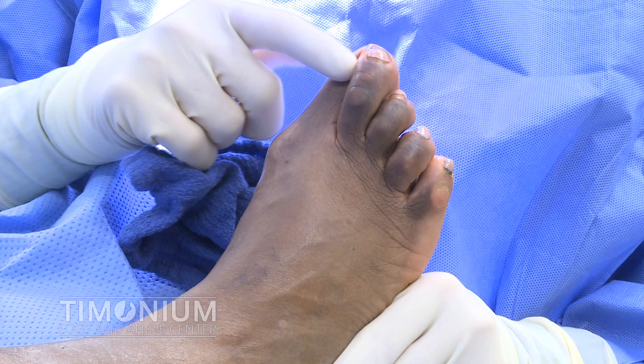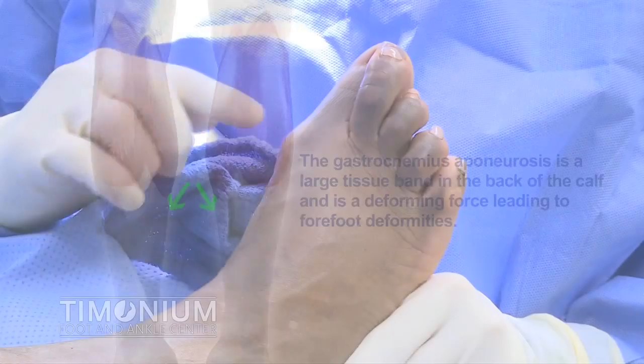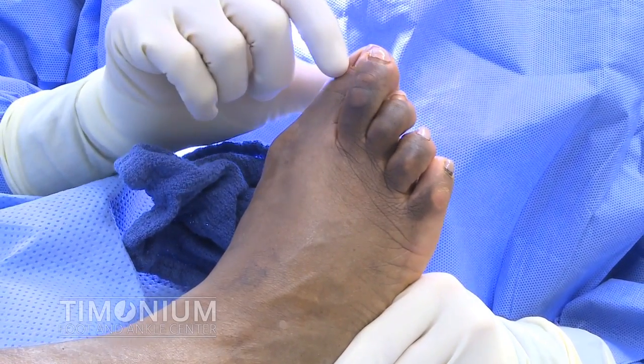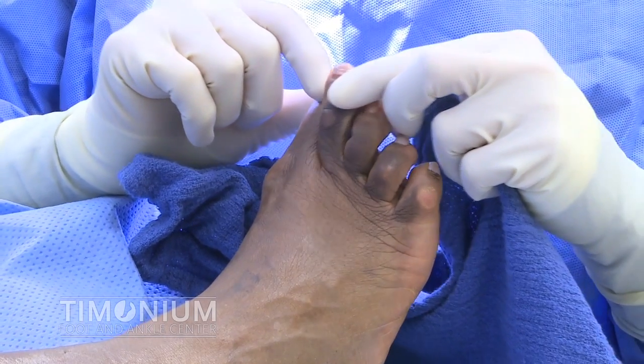Patients will typically complain of pain on the side of the foot, the bottom of the foot, and around the top of the toe. These deformities make wearing shoes very difficult and painful. The gastrocnemius aponeurosis is a large tissue band in the back of the calf and is a deforming force leading to forefoot deformities. This patient has a large bunion and the second toe is overlapping the big toe. The goal of the surgery is to straighten the first and second toes, eliminate the overlap, and eliminate the pain.